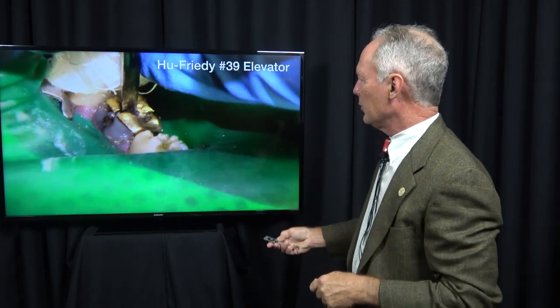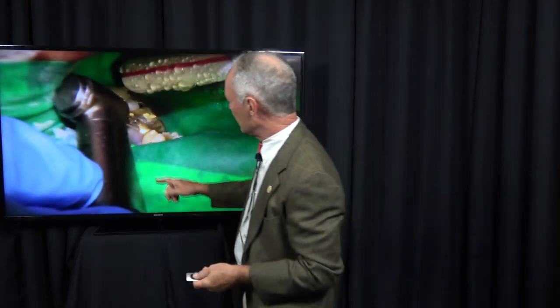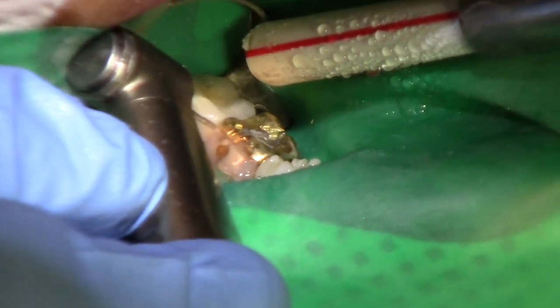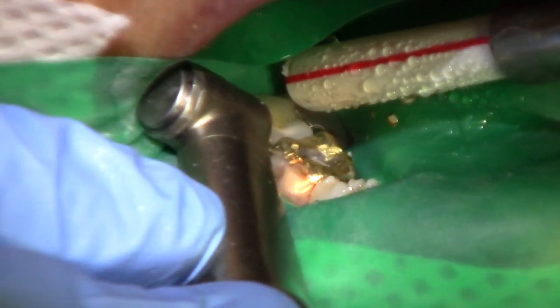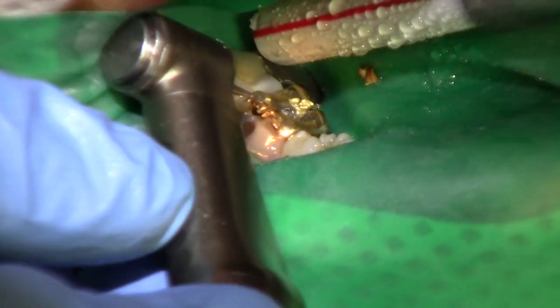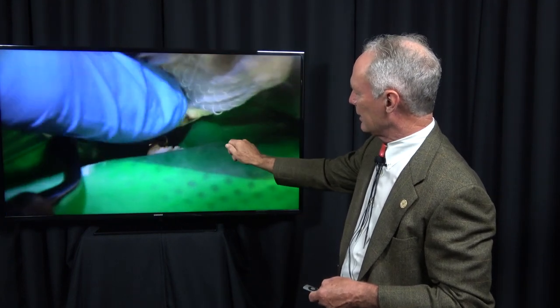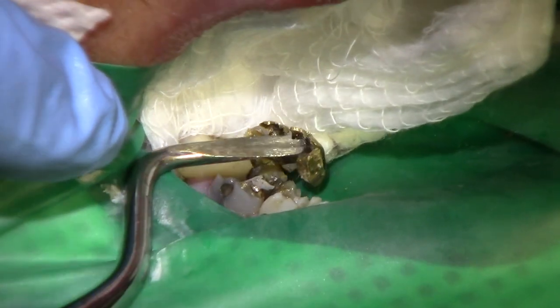You place that in the cut area and just torque it. If for some reason they don't torque, you don't want to break off a cusp, so I'm making a cut right at the margin of that crown, a bit into the tooth, but most of the cut is actually into the crown. I've got a leverage point, and then I'm going to place that elevator in that cut and gently lift those pieces off the tooth.